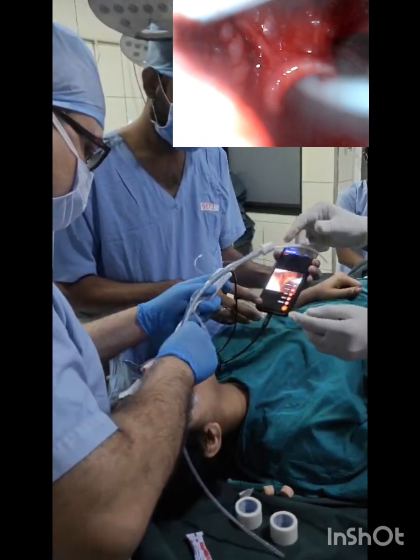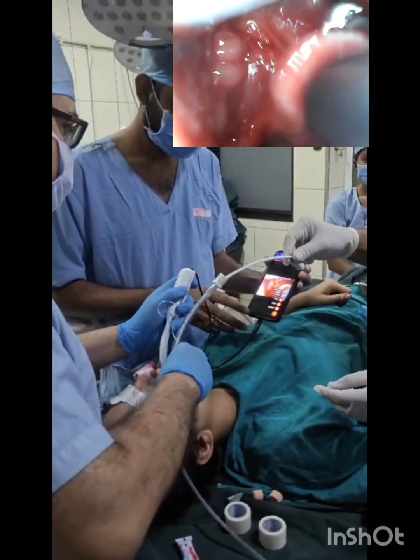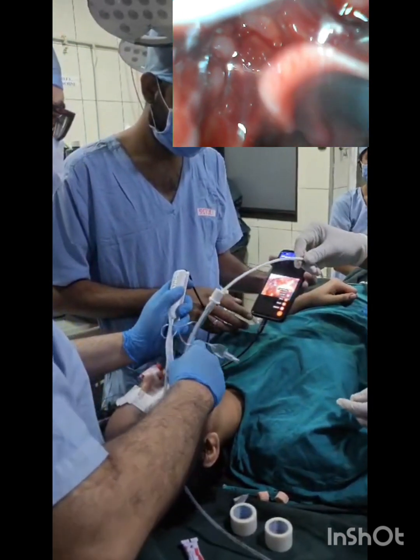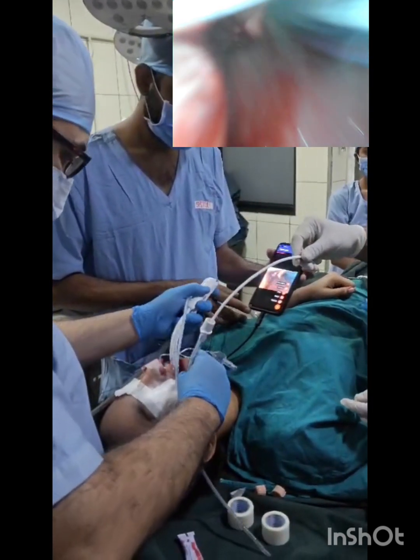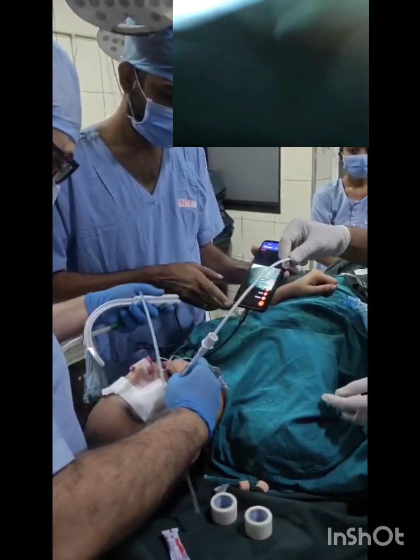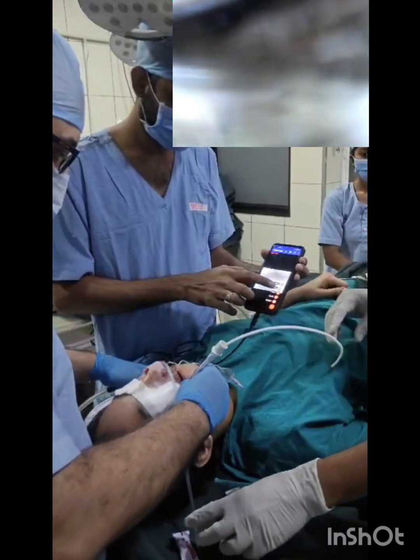This is how, without taking much support from the mandible, we can easily intubate in such cases.